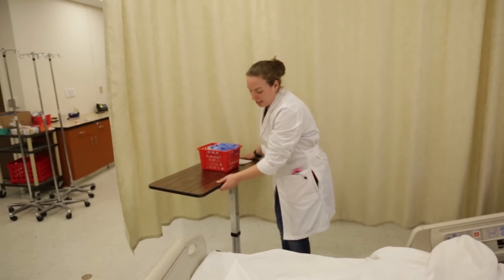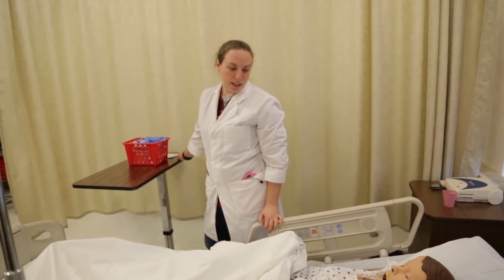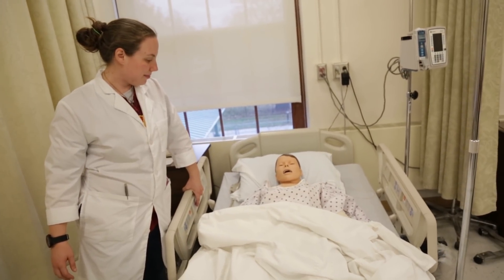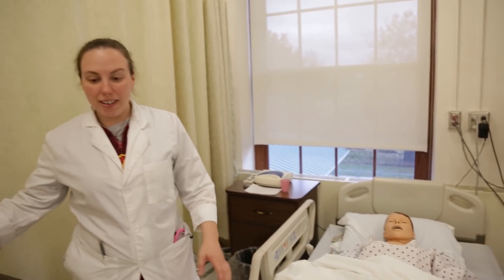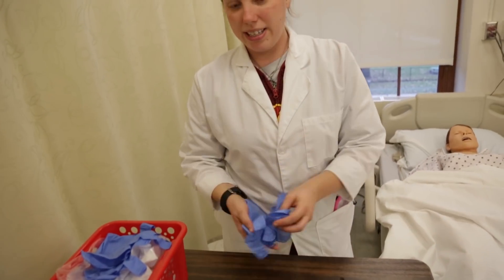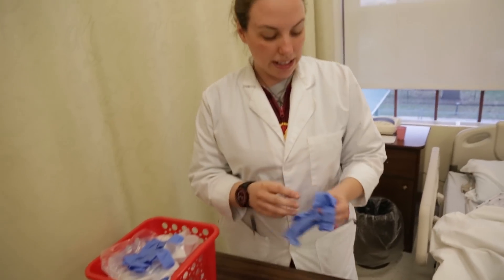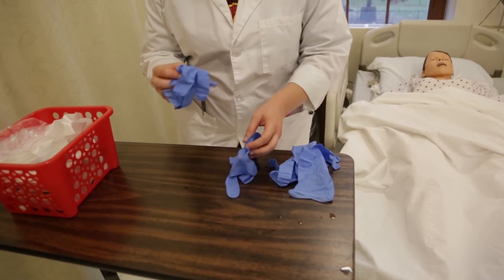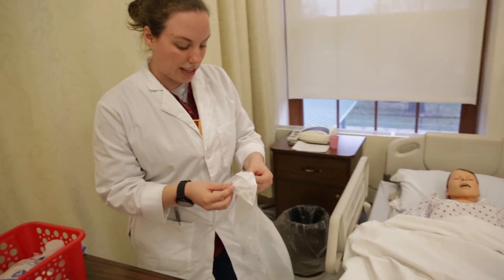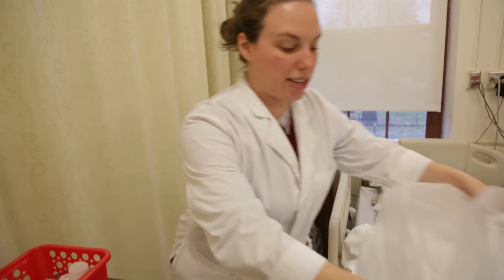I explain what I'm going to do with the patient. Today I will be doing a wound dressing change from moist to dry. I need the patient flat because the wound is on his abdomen. Then I organize my supplies. I will be using two clean gloves in the beginning of my procedure. I need the trash bag because I'll be throwing all the wound change supplies right into it, and we always put it at the end of the bed.